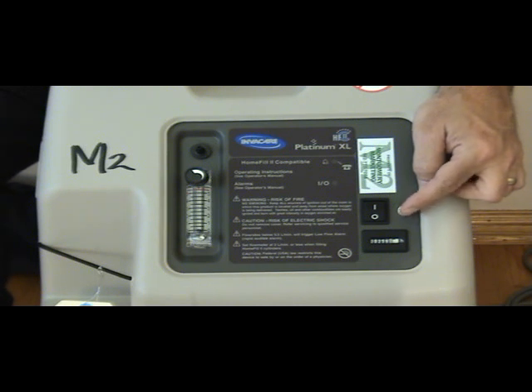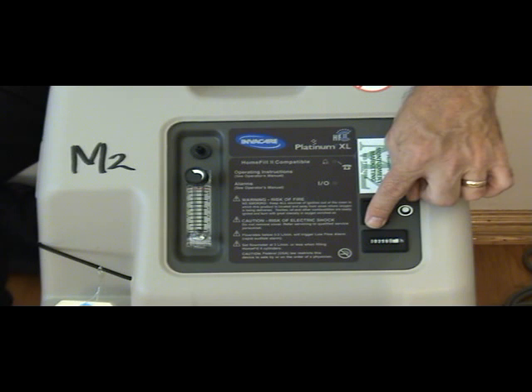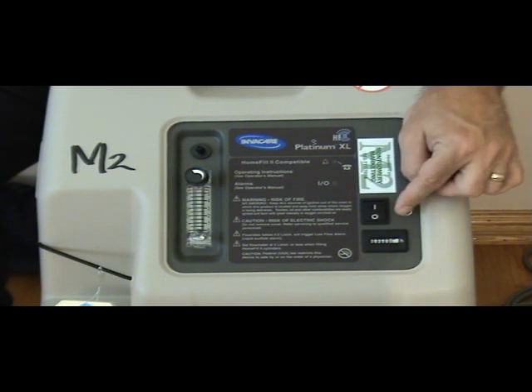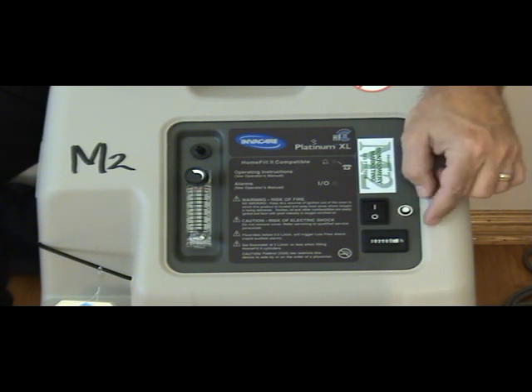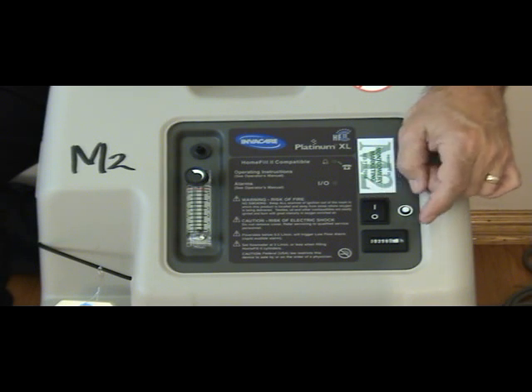When this button pops out, let's say you're in the house and you know there's been a power surge and you know that the lights have dimmed or the lights have gone out. You go into the room, you see that the concentrator is not working, this button has popped out. You need to handle it in this sequence. First thing you need to do is to shut the unit off. Then you need to push the button back into the reset area. Then turn the unit back to the on position and it should reset and continue resuming normal operations.